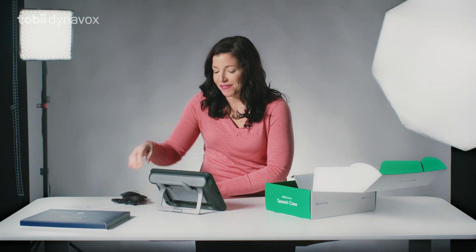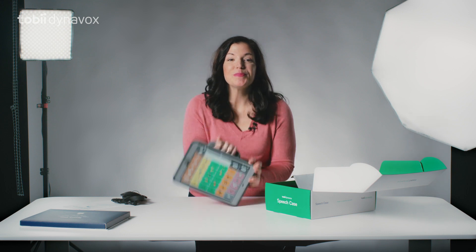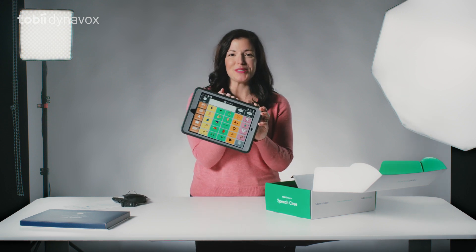And there you have it — the all-new durable speech case.